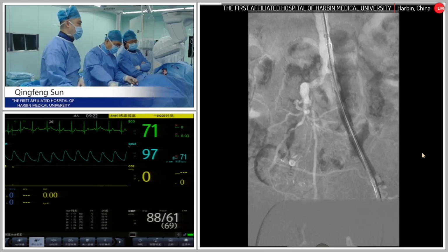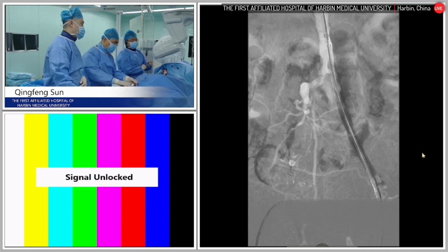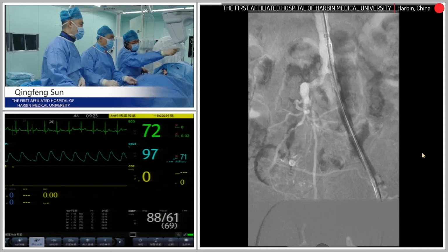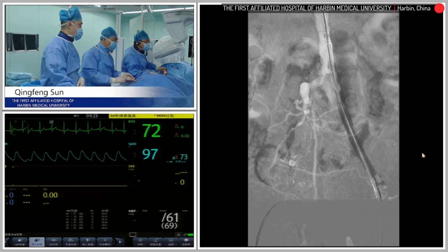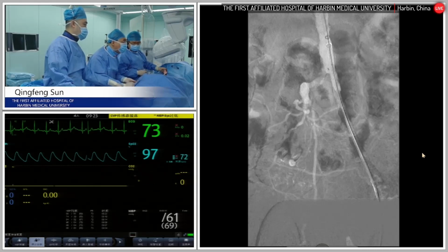Very interesting. Like I said before, I learn a little bit every time. Tips and tricks. I think the location is good for preserving the internal iliac artery. Yeah. I think maybe we use the angiography to test. Okay. Looks much better right now. Yeah.